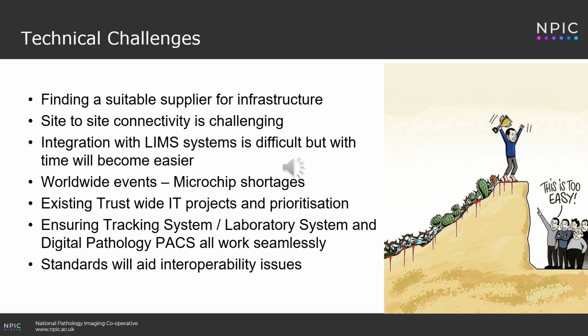Site-to-site connectivity is challenging, especially because there's lots of security-related things that need to be done. Firewalls, ports, antivirus software, all of those components tend to create connectivity issues. And what we would say is certainly look at dedicated site-to-site connectivity if you can afford that.